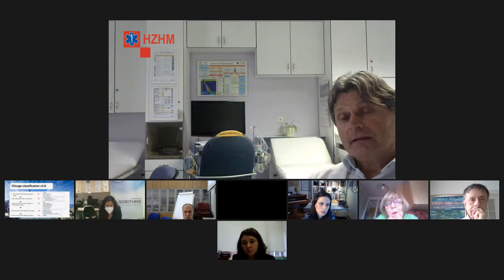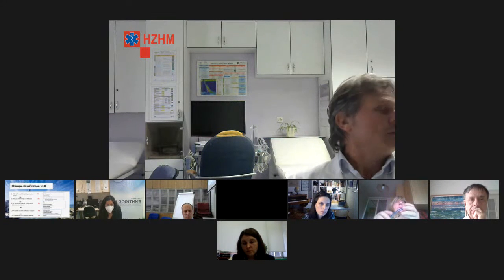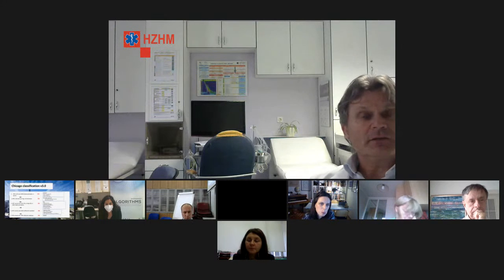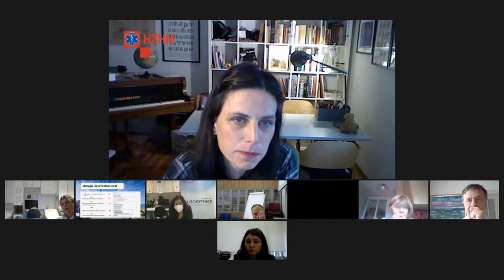Taj solid state kateter kod nas košta 220.000 kuna. Vi na Reboru imate samo solid state kateter, baš sam vas to htjela pitati, s obzirom da imate i silikonske, kako su komparabilni vaši rezultati.